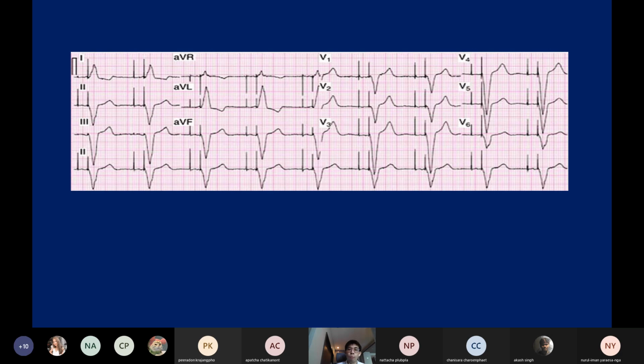But in this case, it might be hard to understand. In a dual chamber pacemaker, the ventricular lead can respond to the intrinsic rhythm from the atrial lead. If there is an impulse from the atrium traveling down to the ventricle, it will see the impulse, and it could either inhibit or trigger.